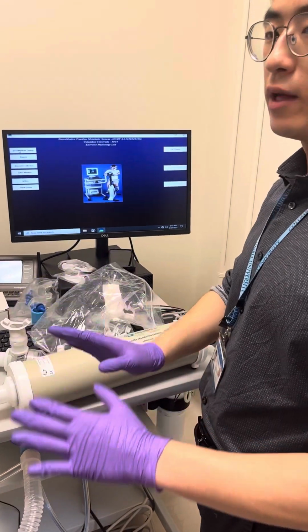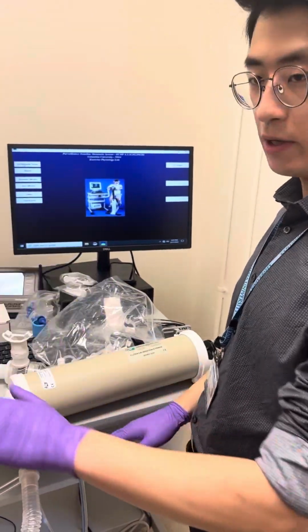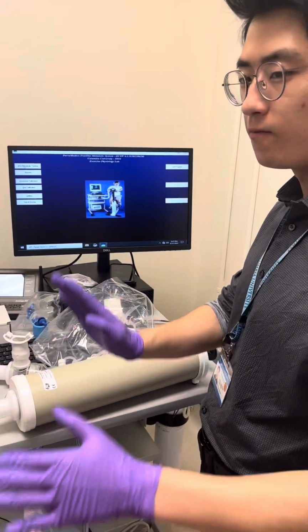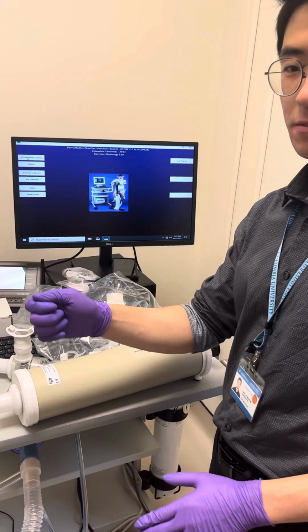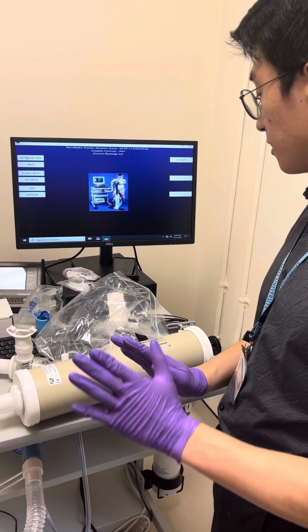You might want to do that once at the beginning of the day before anyone comes in, just to make sure that the bike is connected. Last time what happened was the bike wasn't connecting. It was like COM4, like some file is missing. I just unplugged and replugged the USB and it worked. So the stuff can be a little finicky.